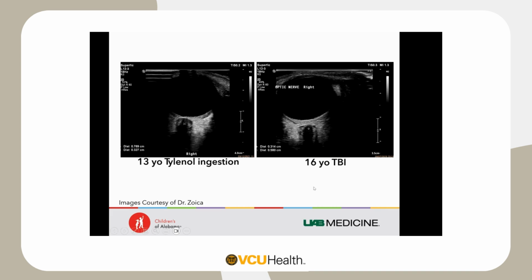And this is where it gets into the gray area when you don't have the best normative values. Because if this was just a pure adult, you could say this might be in the range, but it is important for pediatrics to have their normative ranges, being that this would be a sign of increased intracranial pressure for this child.